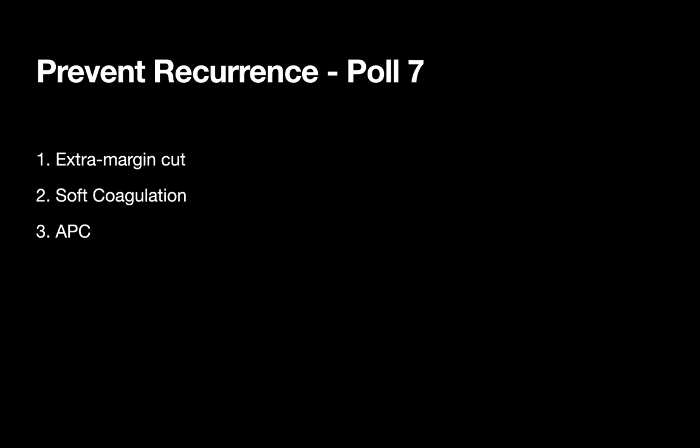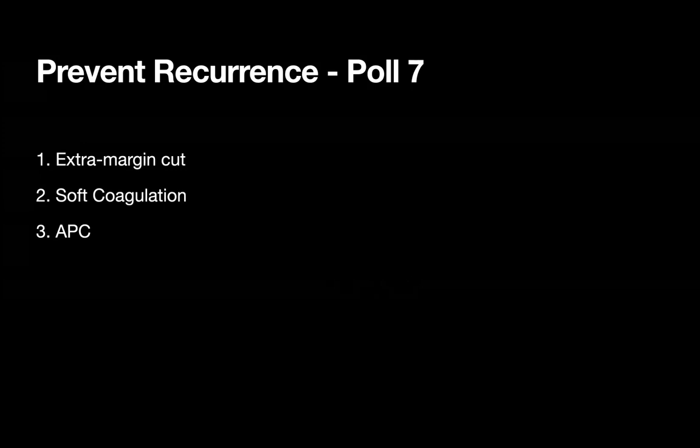I think I would follow the same steps as Roy described, and I would try in the end to document, as we have repeatedly talked, the resection place. So to demonstrate that I have done the hemostasis appropriately, and there is no residual tissue, residual adenoma. All right, straight down.